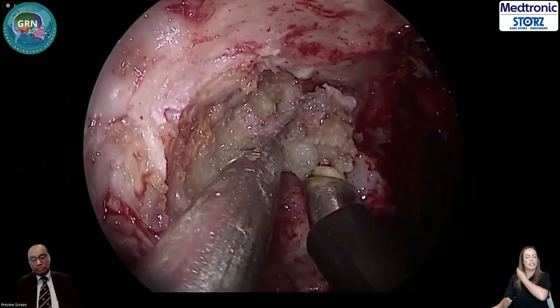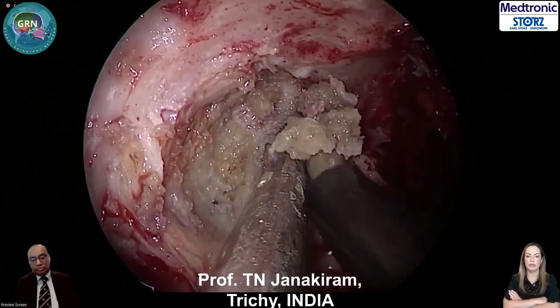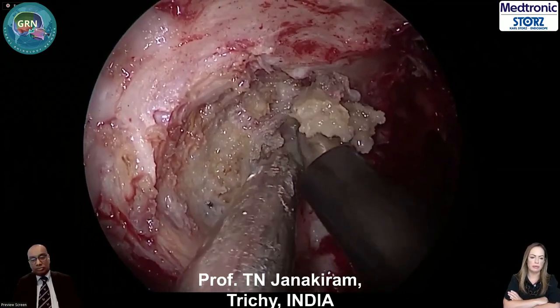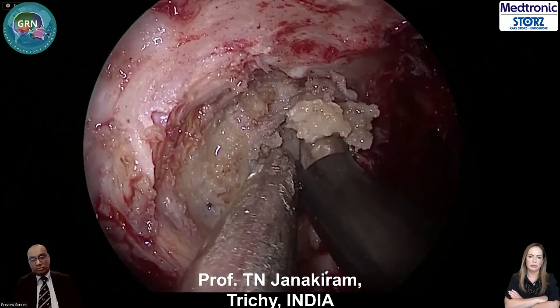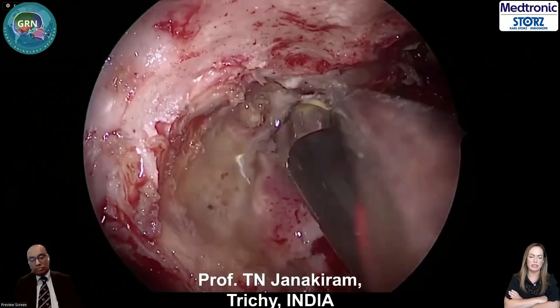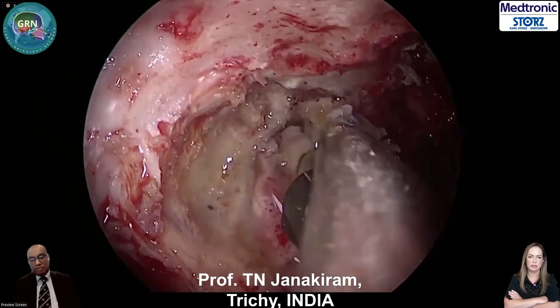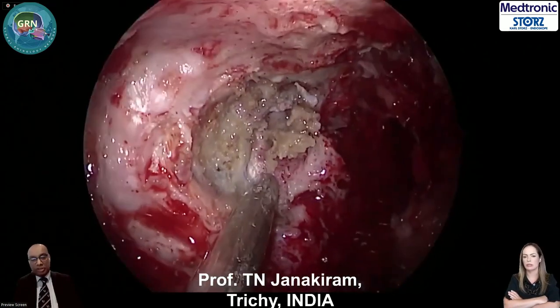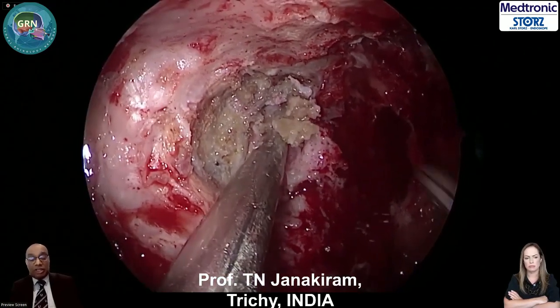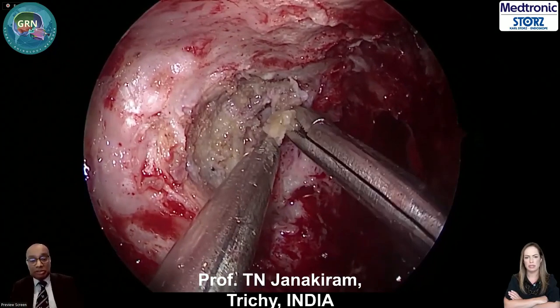I really can't imagine how you would do that dissection without the coblator, because to try and get through all that fibrotic scar tissue, you would almost be using a sort of sharp dissection, which would just result in bleeding. It would be extremely difficult, wouldn't it, Ashok? Absolutely. It also has the ability of feeling the bone behind it. That's right, using it to palpate.